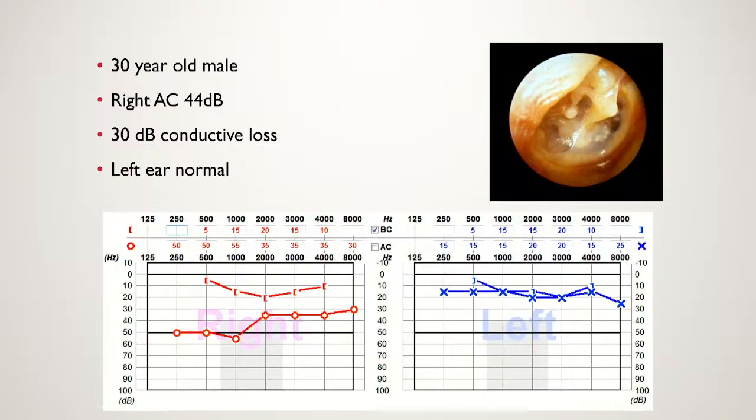Yeah, hearing aids, take the microphone. Assuming we're having surgery, but obviously you have the hearing aid discussion. Do you push them for hearing aids in something like this, or would you fancy your chances with this one? No, I do offer it to them, but a 30-year-old most of the time they're going to go for surgery. So what's your surgical approach for this then? It would be an endoscopic approach using the microscope as well. It would be transcanal permeatal, and I would think of one of two options: either stacking cartilage, a piece of cartilage and then a second piece on top of that for the retraction, or a clip-in cartilage.